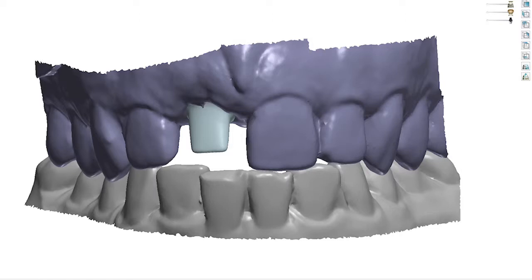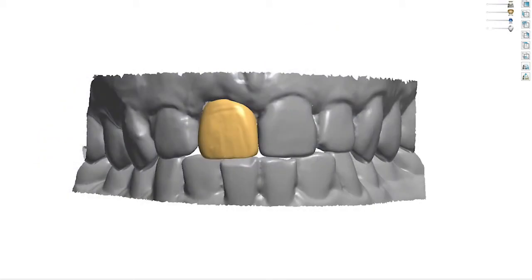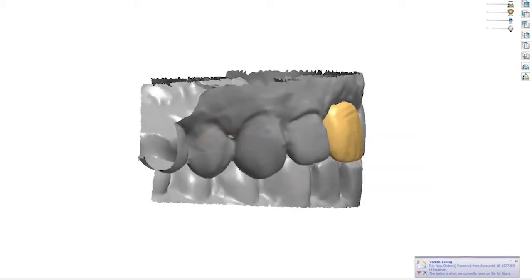The morphology of the custom abutment mimics the root form of the tooth being replaced, fostering a natural emergence profile for the final restoration. The final implant retained crown was designed to mirror the shape of the natural left central incisor, as seen in Figure 21. The final soft tissue architecture of the implant site allows for the construction of an anatomically correct crown shape.